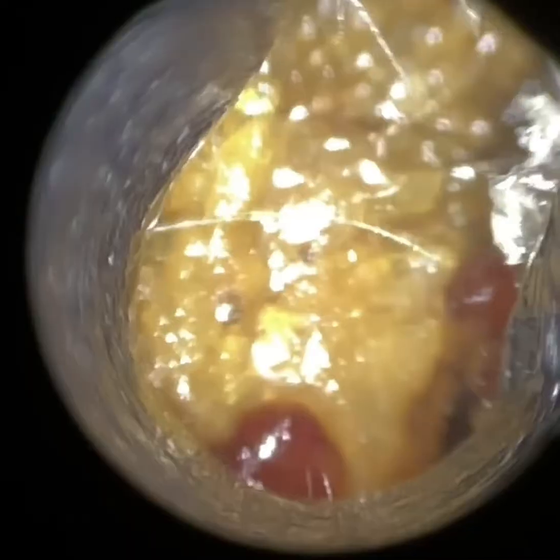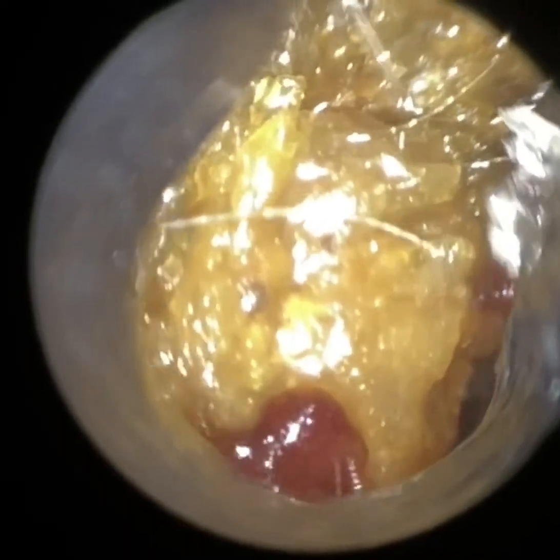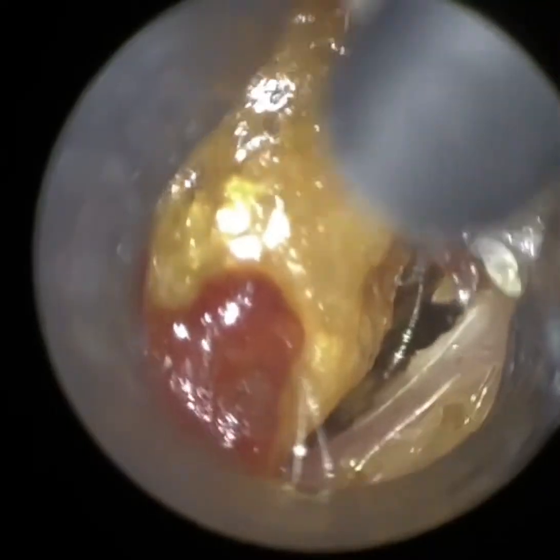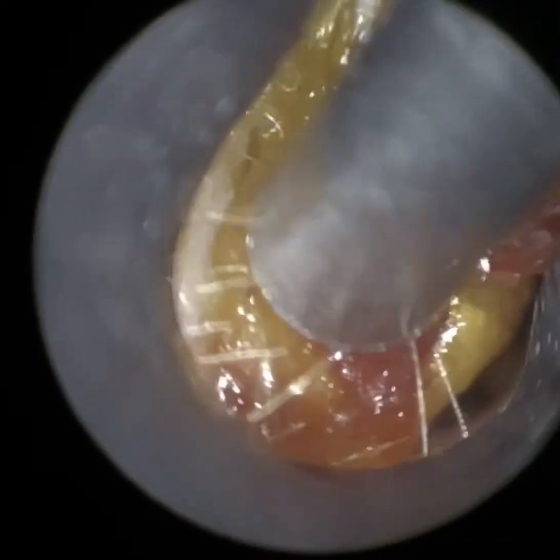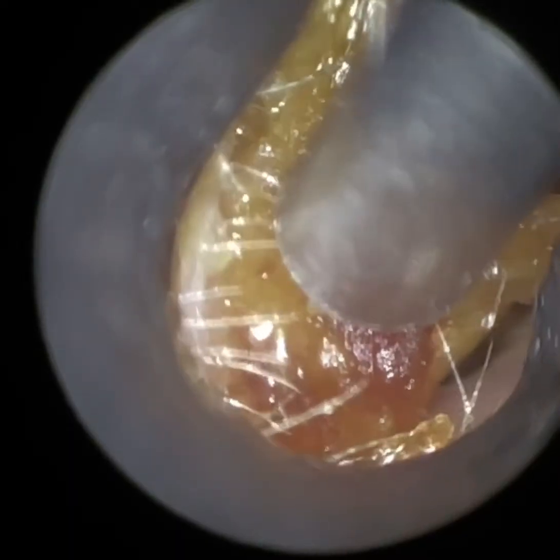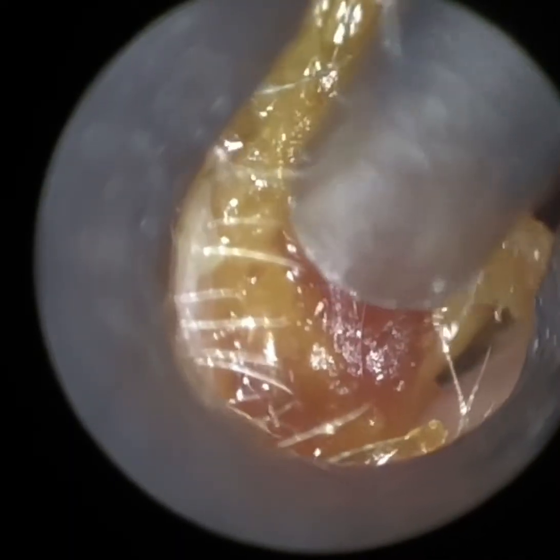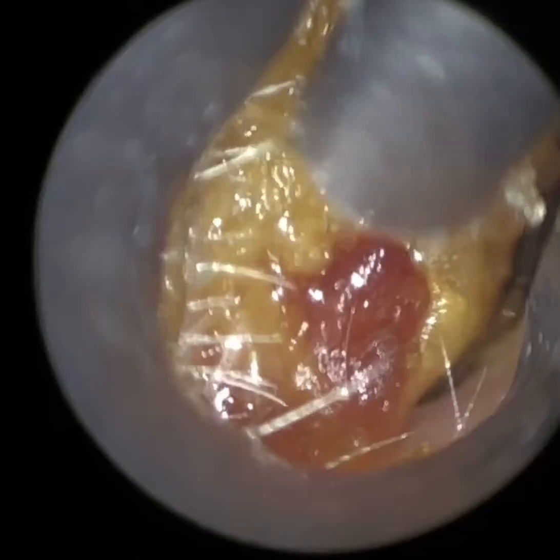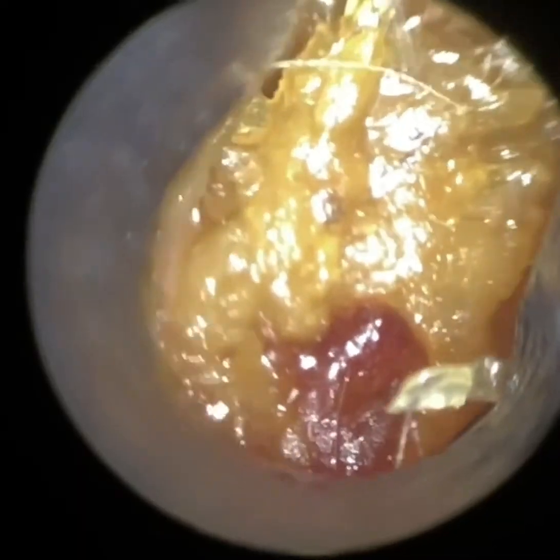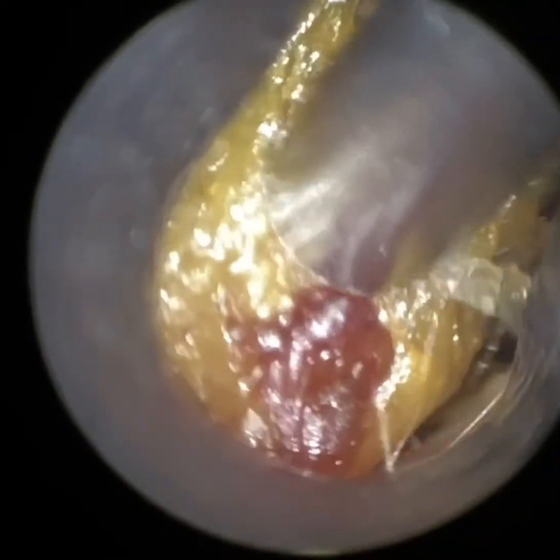The surface of this wax — and keratin, I should say, there's a lot of keratin there — it's very abrasive, very rough, it's almost like sandpaper. So for that reason it's very difficult to remove because the patient can feel it against the canal wall and it can sometimes be a bit uncomfortable. Therefore with this particular patient we always recommend they use some drops prior to attending just to see if we can soften the surface. But despite the patient using drops for a few days, the surface is very, very rough still.